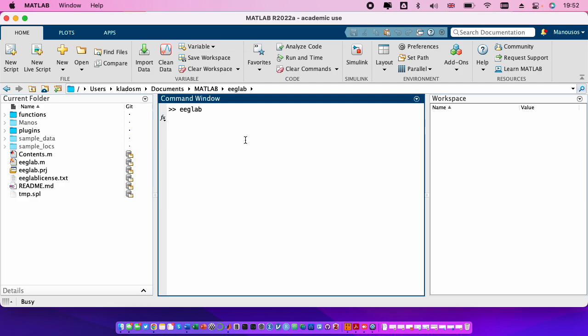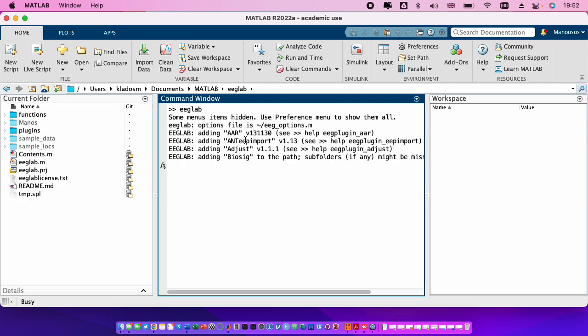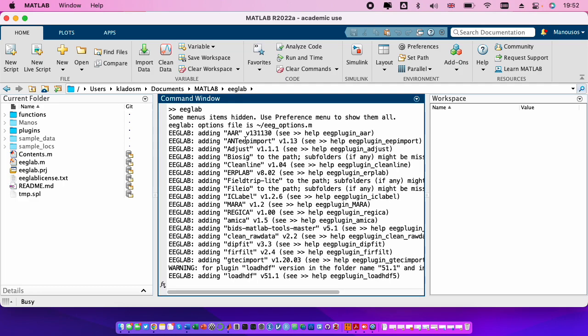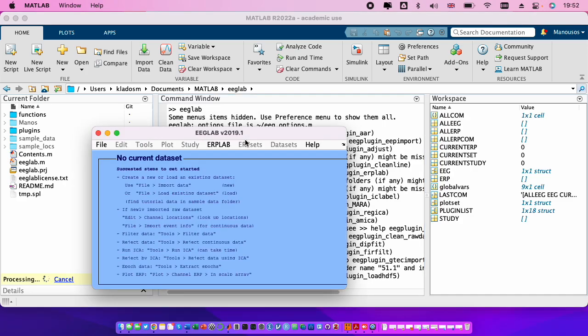This will put in the path all the folders that are needed in order for MATLAB to recognize the EEGLAB functions.